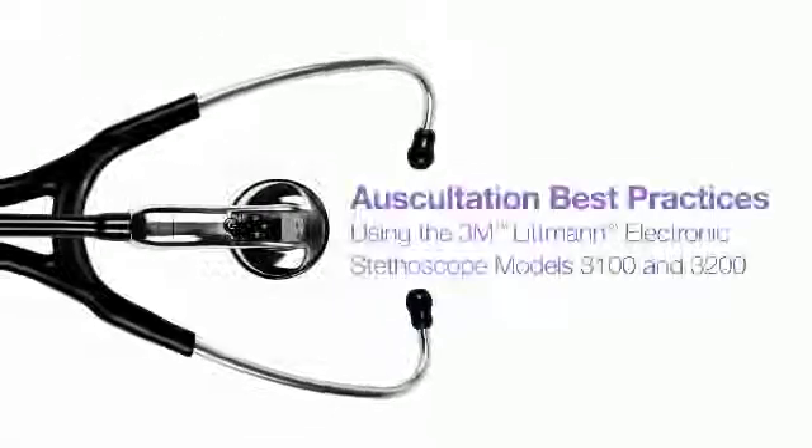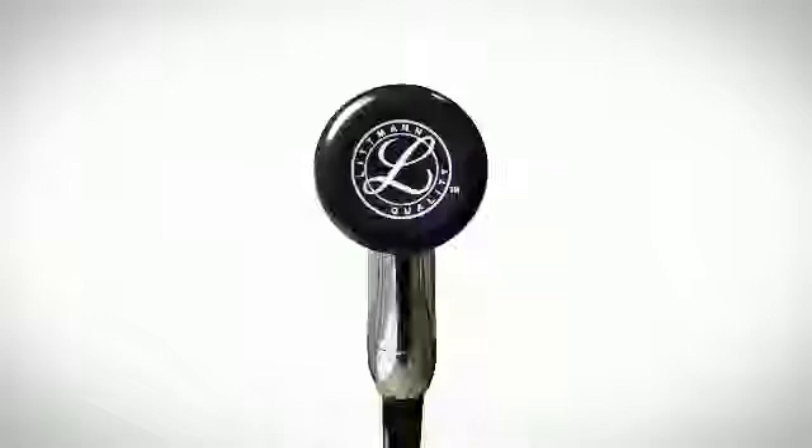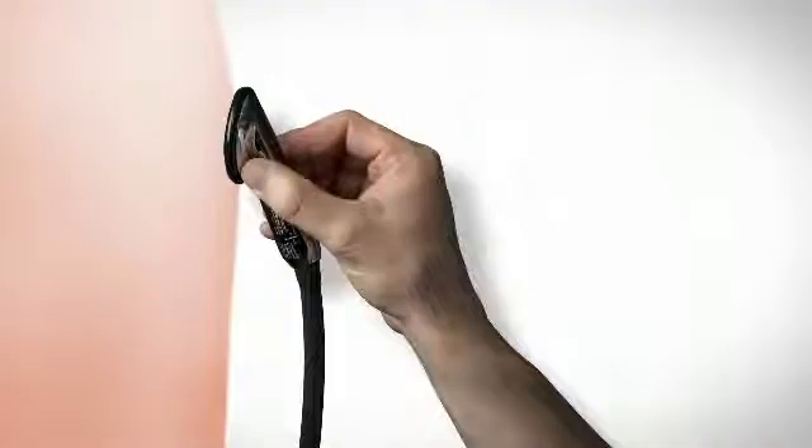This video covers the basic techniques for optimizing sound quality when using the Littmann Model 3100 and 3200 stethoscopes. The sound sensor is located in the very center of the chest piece. Make sure that your point of contact with the patient is centered directly under the chest piece.